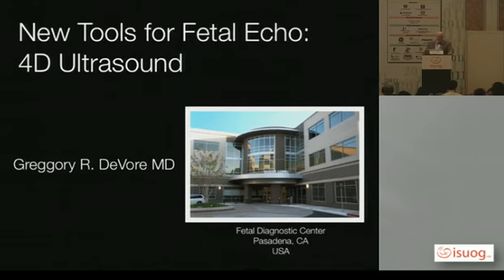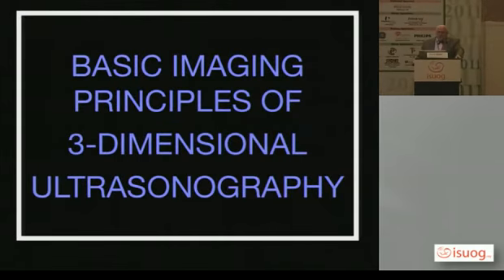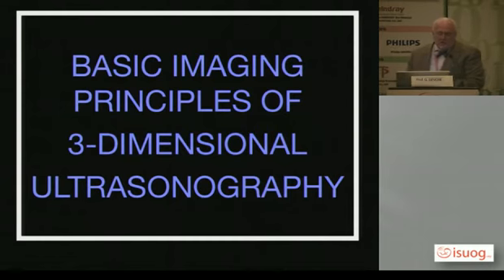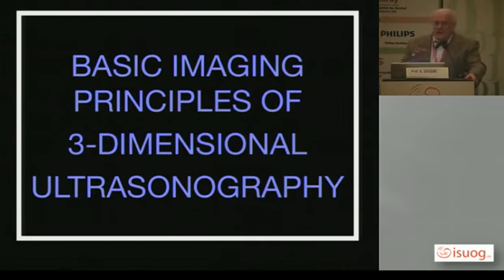The title of the talk is New Tools for Fetal Echo 4D Ultrasound. The first concept we're going to discuss is the basic imaging principles of three-dimensional ultrasonography. Now, as you are aware, there are 3D and we talk about 4D. So first we're going to discuss the principles of 3D ultrasound and then go into the 4D or the STIC acquisition.